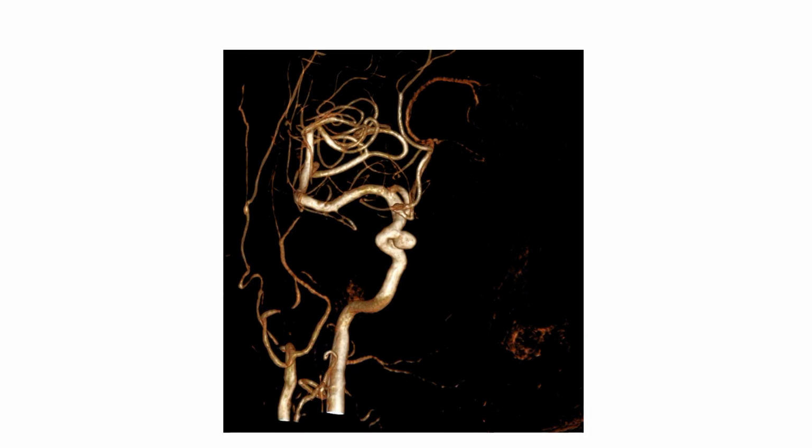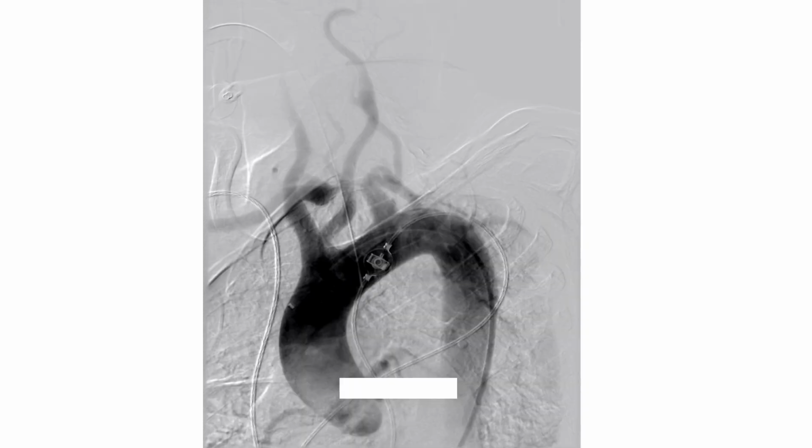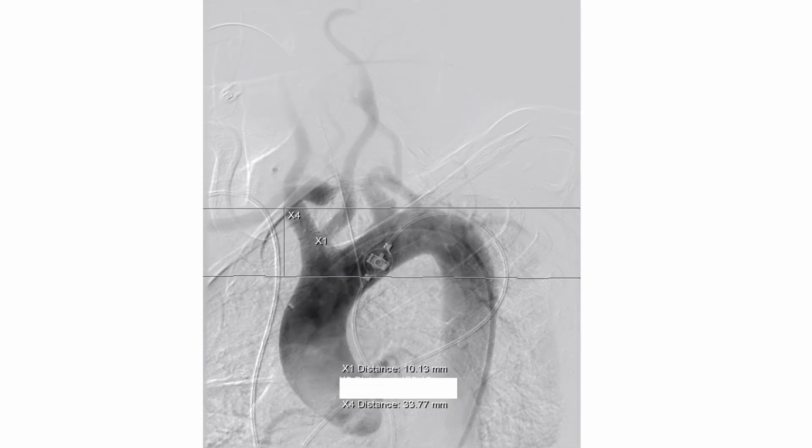So this is a vessel, there's an aneurysm out here and we want to treat. But the problem out here is, can you see the carotid is taking its takeoff at a position that is really low. And now if I want to take a long sheath across, I find it difficult because it is difficult to cannulate this vessel. So how do I go about having a long sheath in position and then trying to cannulate it with an angle catheter? So this is what we face. It's a type 3, a difficult anatomy, and how do we do it?